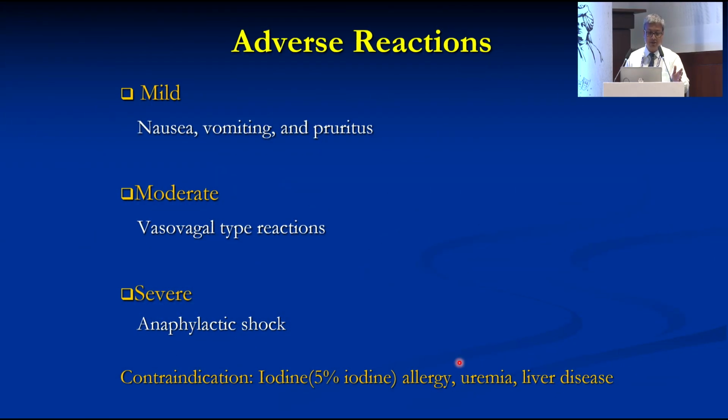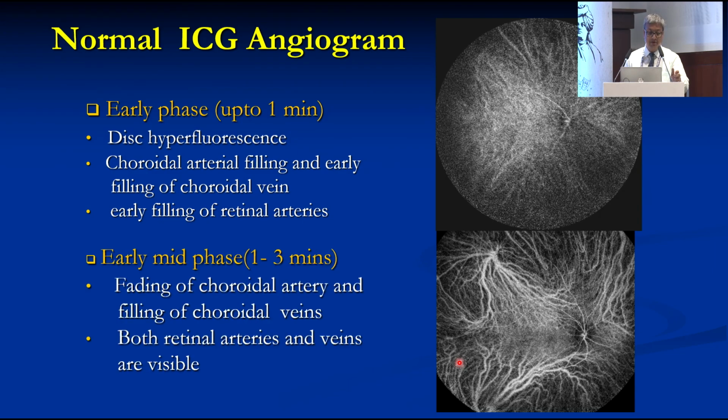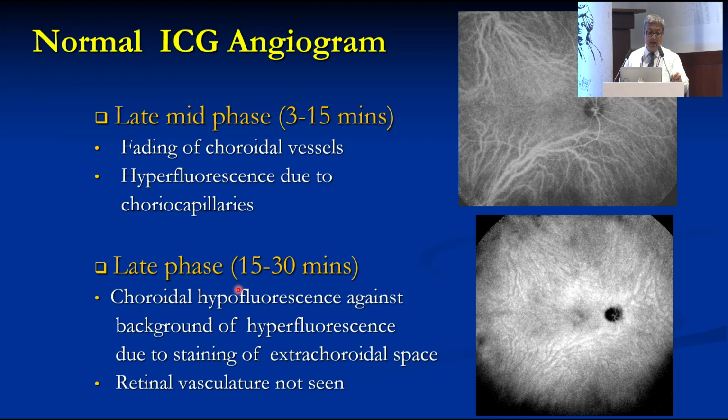Adverse effects are nausea and vomiting in some cases, and severe anaphylactic shock is rarely encountered. In angiography, there is an early phase, an early mid phase of 1 to 3 minutes, a late mid phase, which is the most important phase, at 3 to 15 minutes, and a late phase at 15 to 30 minutes.